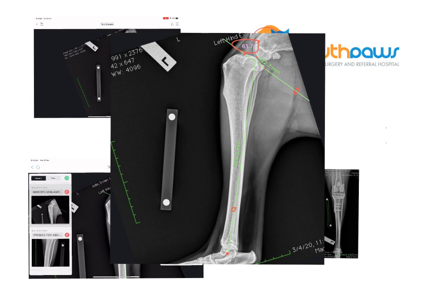We're not going to use 61.7 degrees directly. The tibial plateau angle is actually represented by 90 degrees minus 61.7. So the tibial plateau angle is this angle here: 90 minus 61.7 leaves us with 28.3 degrees, which is our tibial plateau angle.